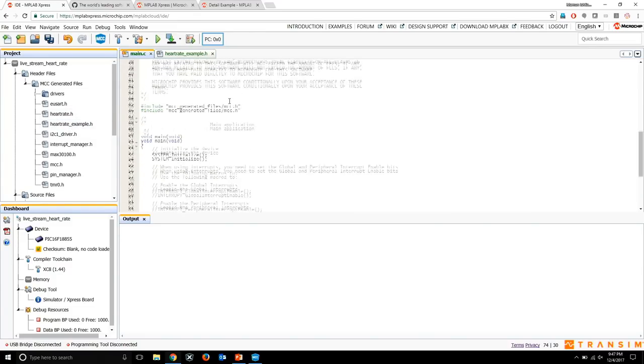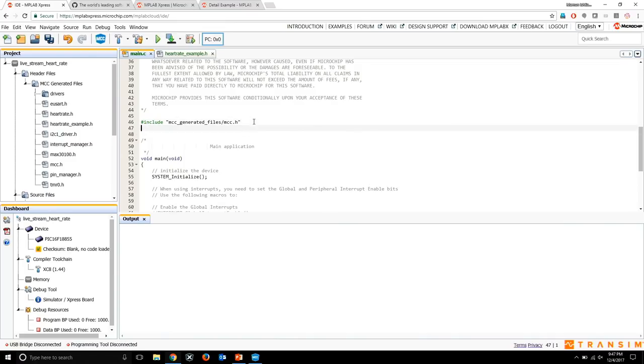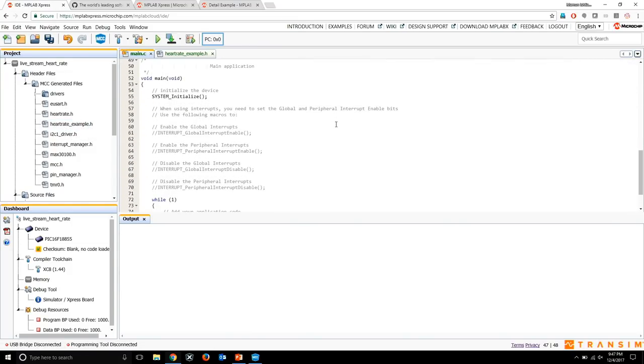How you're going to do it: on the top, in the include section, I'm going to copy the whole line, which is the include for the mcc.h file, and paste it right underneath. And right below, I'm just going to edit the path to heartrate_example.h, and then it should be able to see that file, which is now pointing to heartrate_example.h.